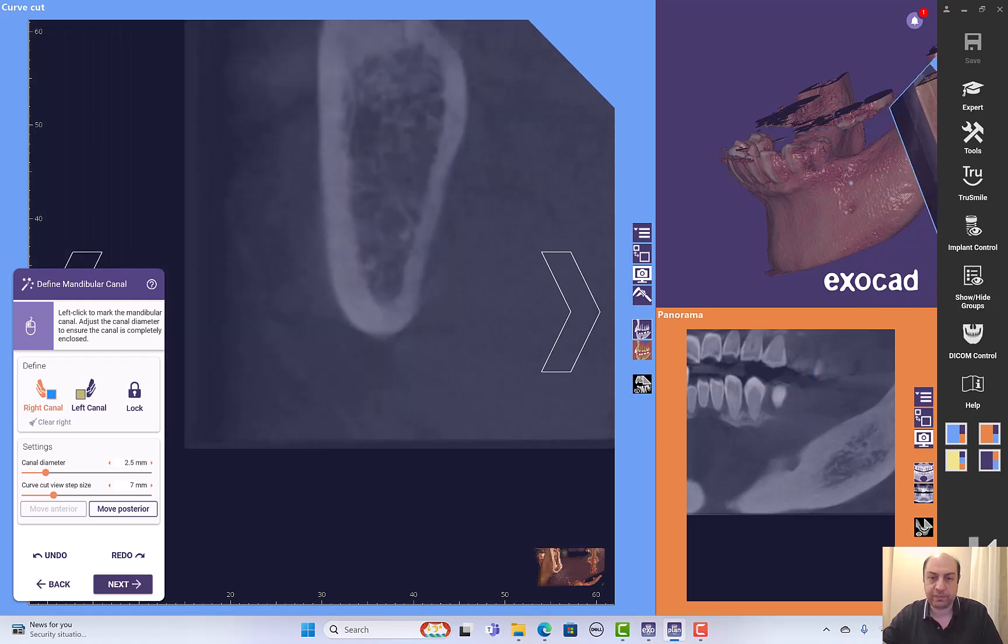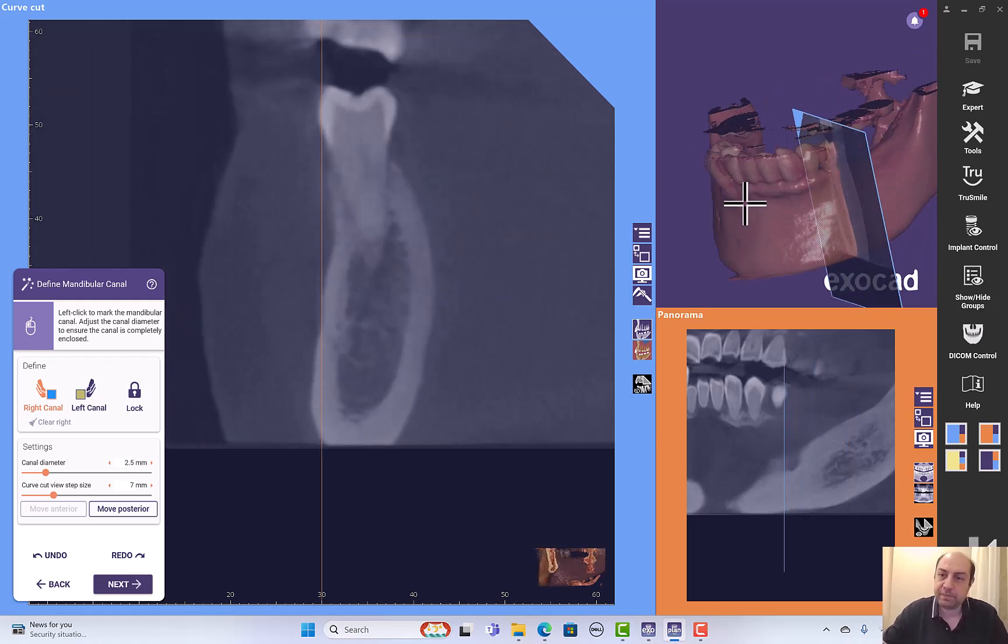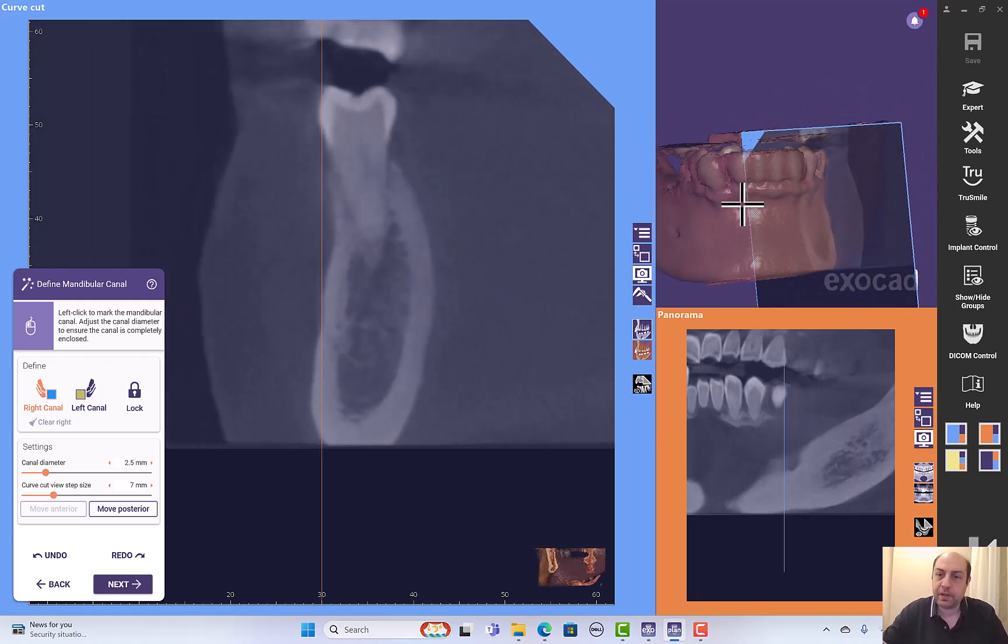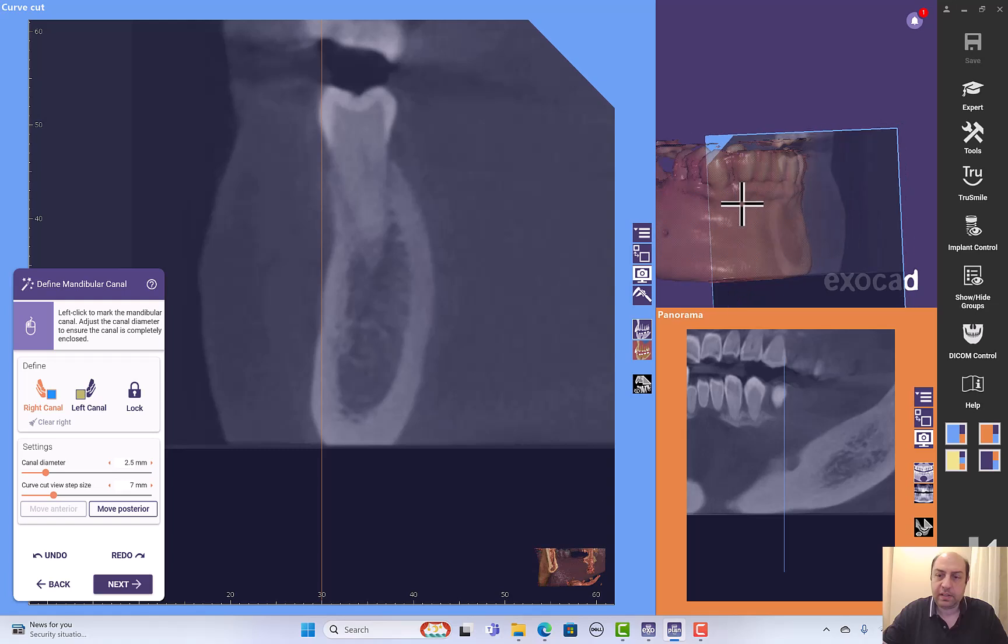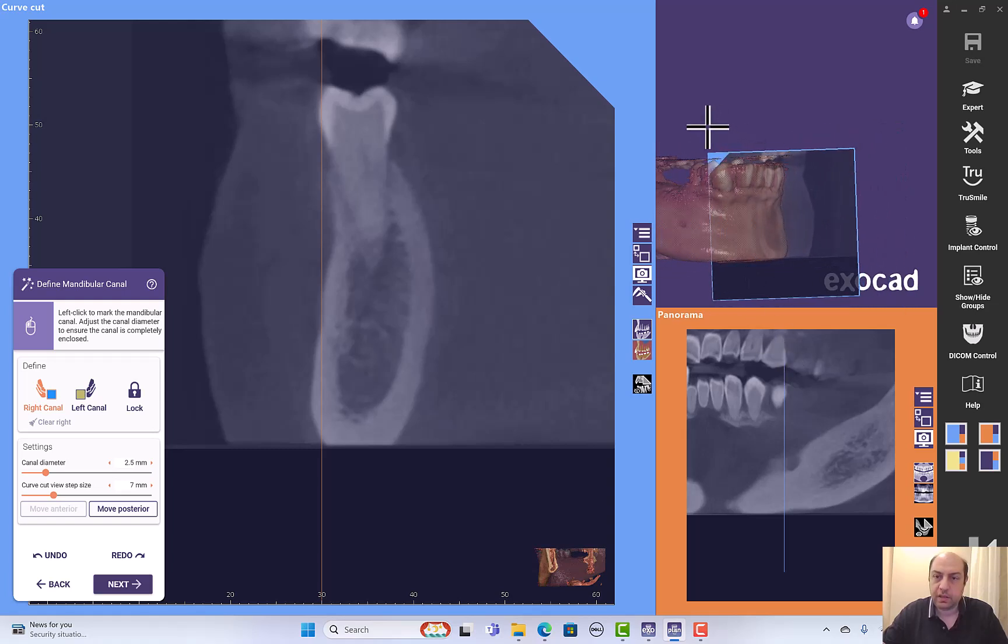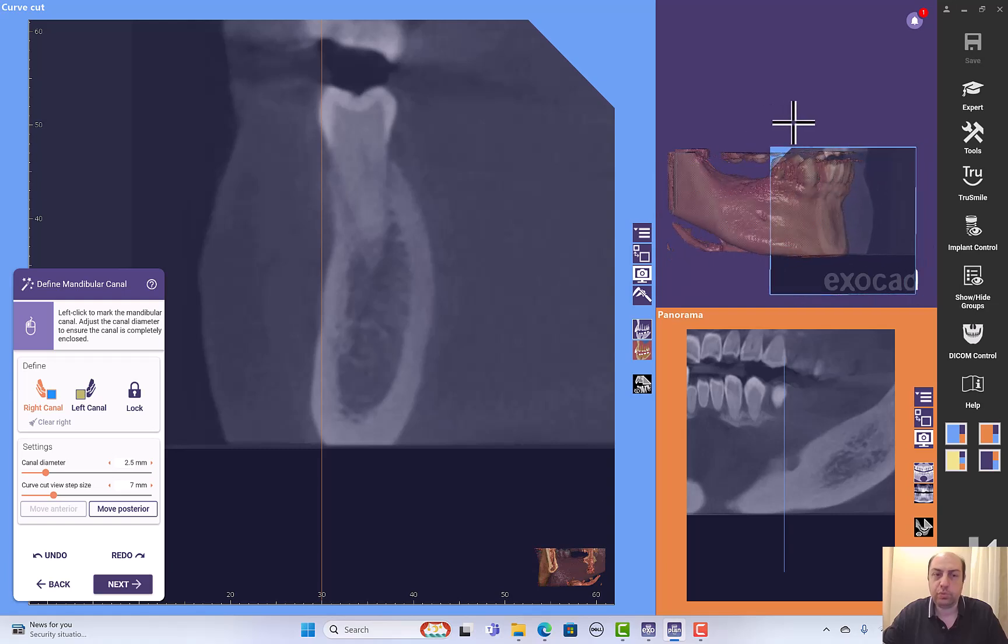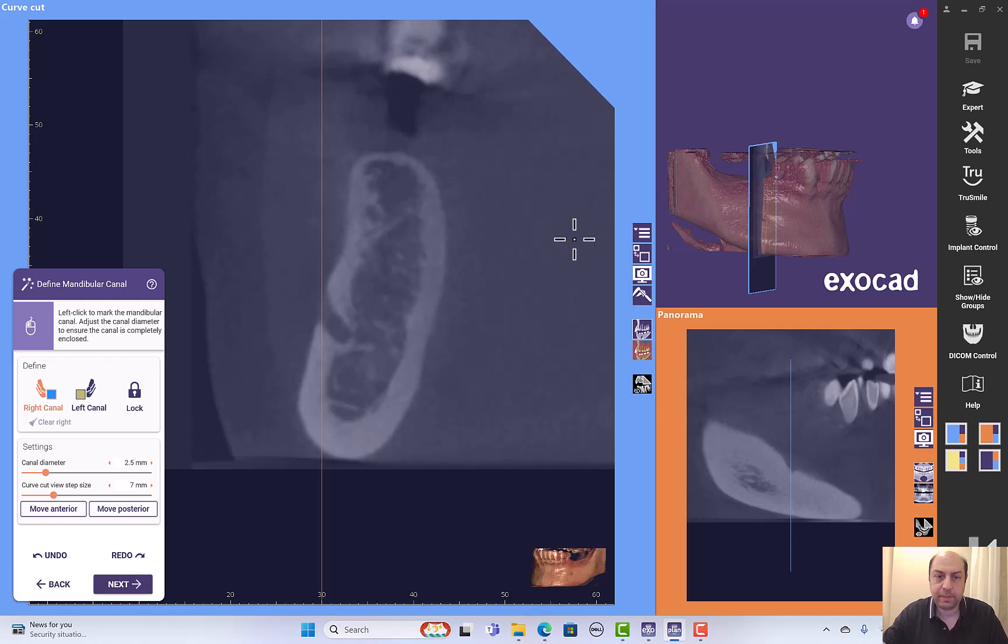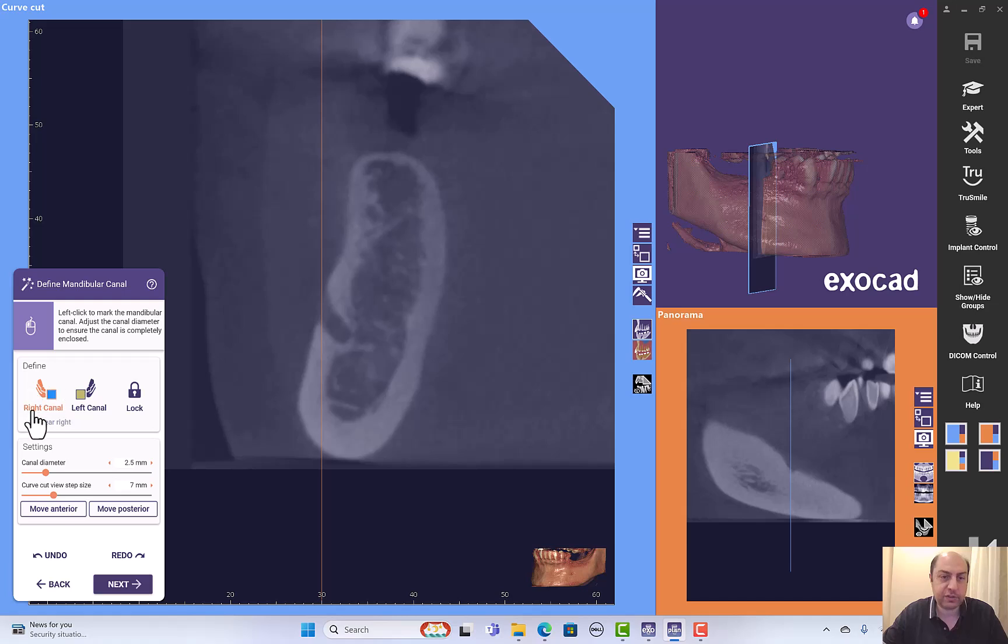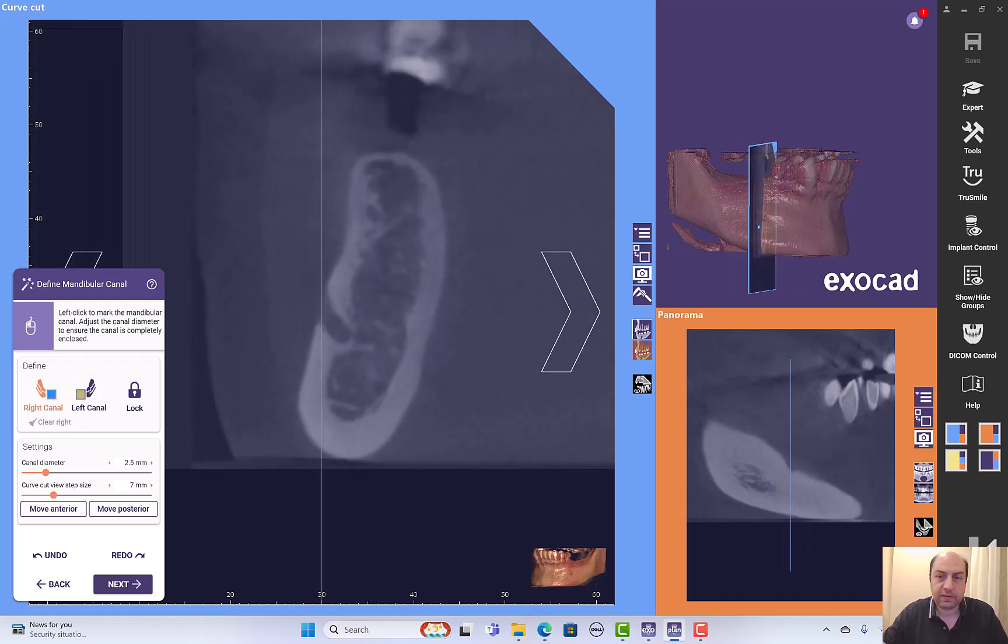We have to start here. Let's start with the right side. We can start with a visible landmark which is the mental foramen. Here we have right nerve and left nerve. Be sure that you are adding the correct nerve. So this is the right nerve.